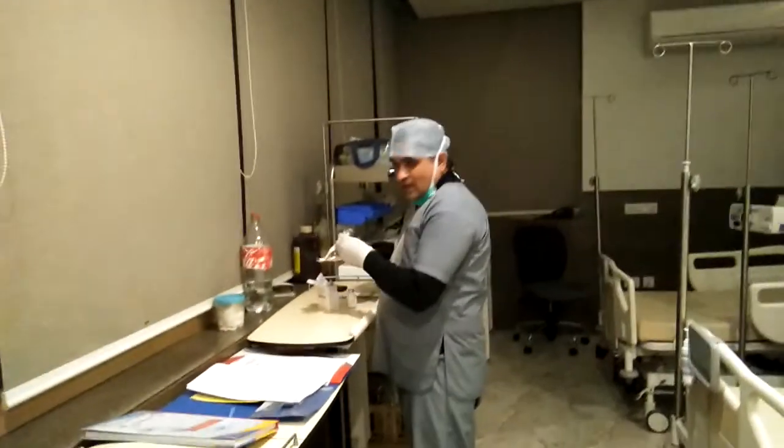He is putting this blood into a yellow bag because there should be no air inside it. Now he is emptying the tube. He has already primed the blood into the tubing, and now we are going to insert it into the cannula. Now the transfusion of blood is starting, and we are watching — is anything happening, or is it successful?